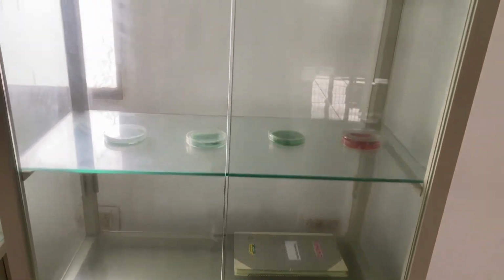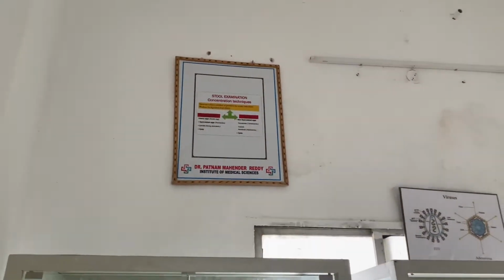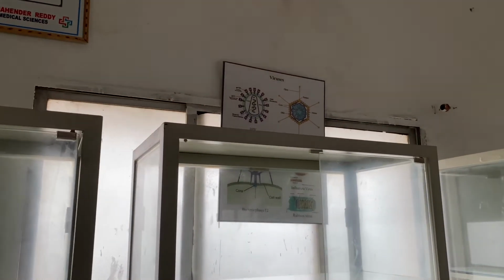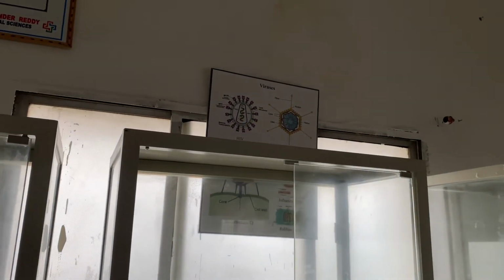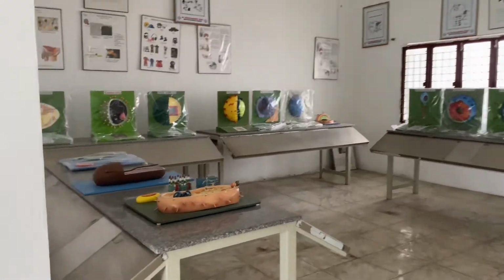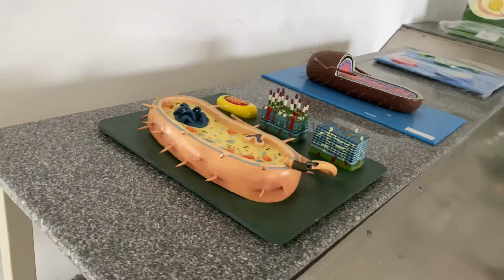Actually we have to fill all the racks with the specimens. For now we have only a few, and we already ordered some specimens. Big companies are there, they provide all these things. I want to show here the models of different organisms.